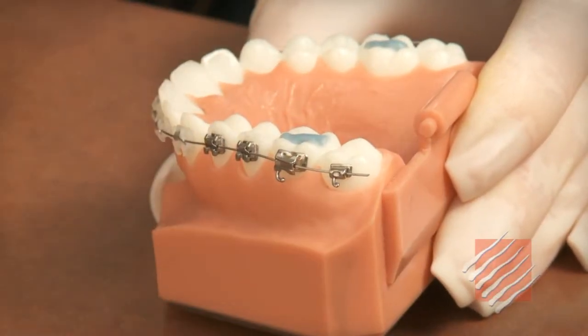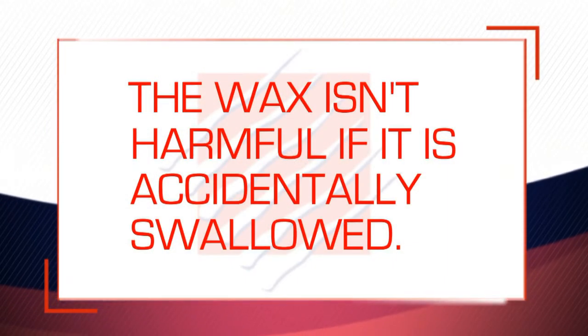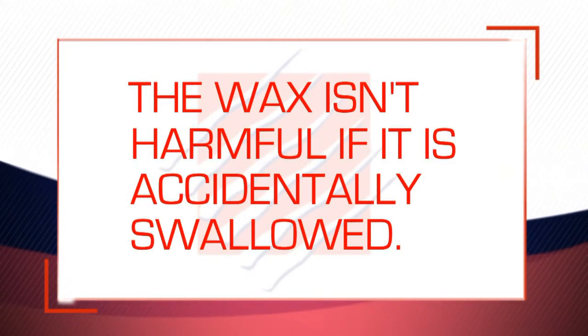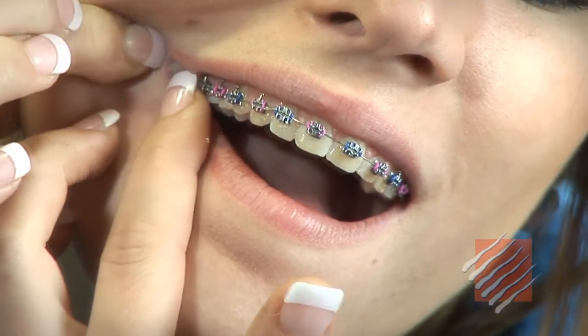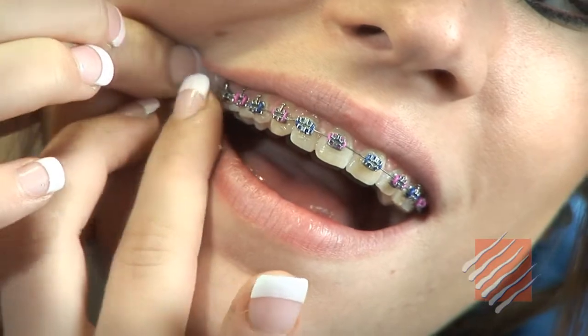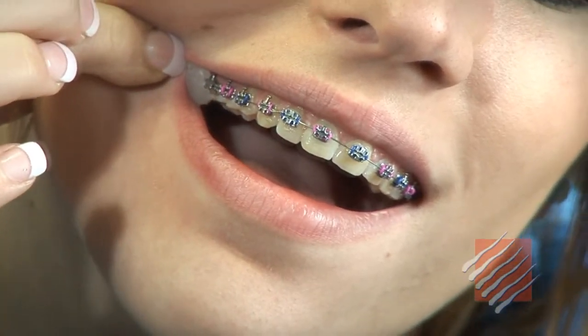Now, if by chance you forget to remove the wax and suddenly realize you've probably swallowed it, don't worry, it's not a problem and it won't make you sick. Just remember to reapply the wax as often as needed to keep yourself comfortable or until you get used to the feel of your new braces.